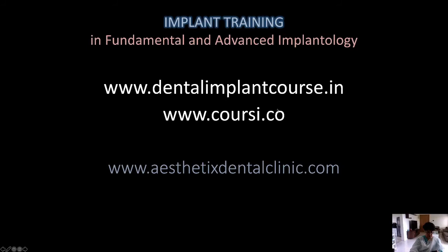Choice of membrane, and how do you decide which one to use and where? Okay, this is Dr. Deepali Bajpayee. Look, my choice of membrane changed with times. Initially, I started my implantology and GBR techniques with Gore-Tex membranes. These membranes are made of PTFE, and these PTFE membranes give good results, but PTFE membranes have a tendency to get exposed quickly.